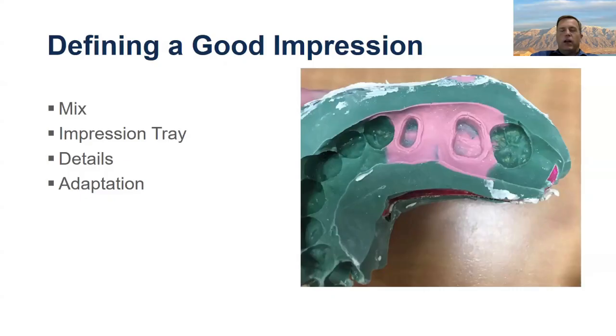And even if we're using alginate or something like that, we need to make sure we don't just slap some water in there, but that we mix. If we want an accurate result, we need to use the appropriate amount of components. Last but not least, when we're using a four-handed technique like this impression with a wash and a base material, we want to make sure that the wash and base have the same set. In other words, we don't want to use a slow set base with a fast set wash or vice versa. And it's better if they're the same brand.